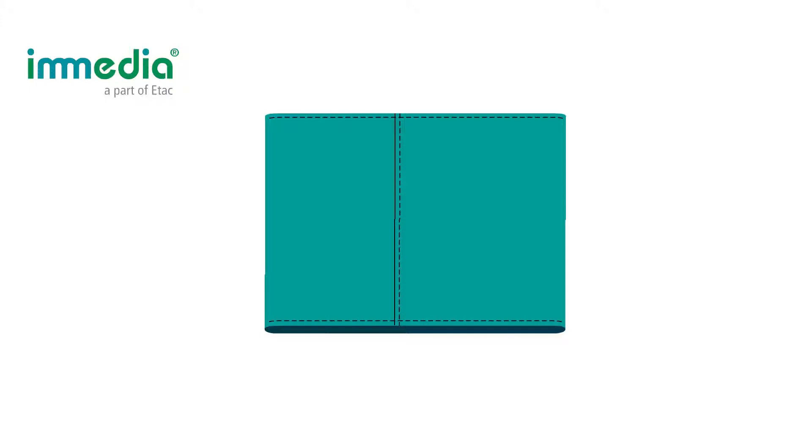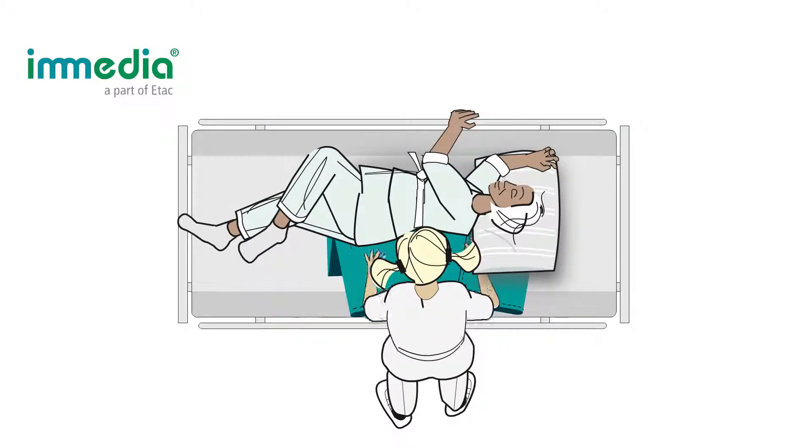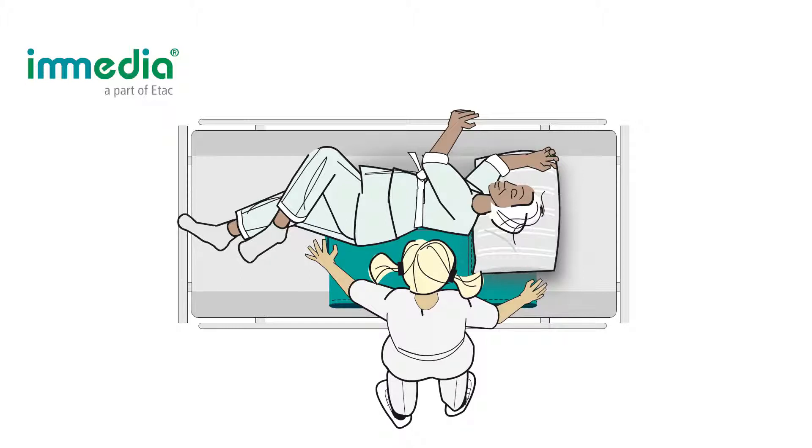Place the Multiglide on a flat surface with one of the open sides facing you. Grab the outer edges with your hands and fold up the fabric against the far opening. Place the Multiglide stretched and close to the patient's back.